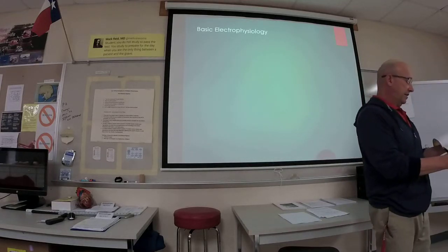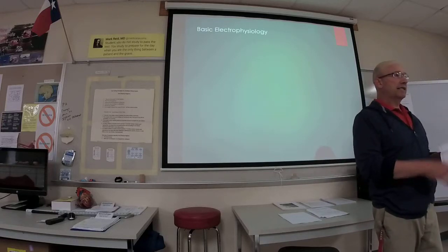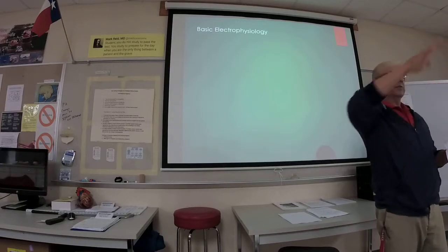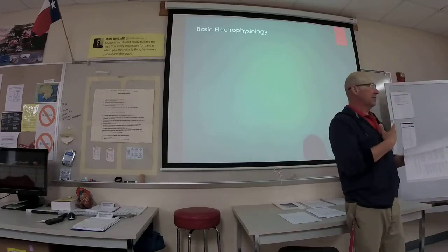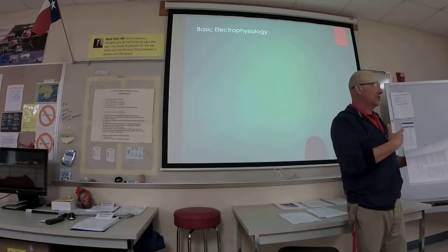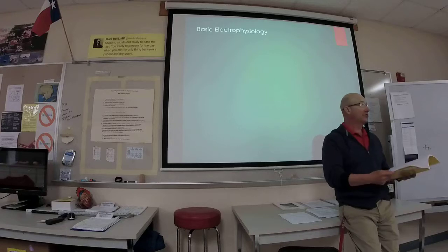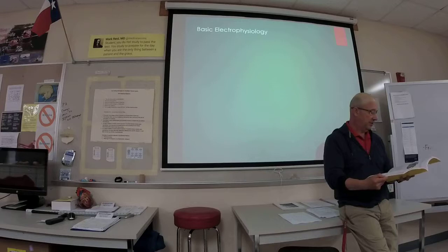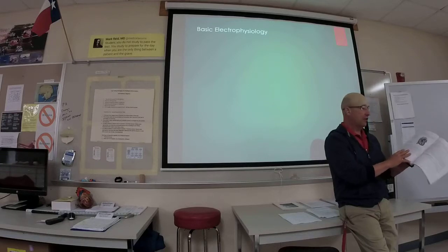We'll talk about different things, artifact and wandering baseline. In the hospital, you've probably already seen the EKG going up and down, and it's just artifact. Artifact is something that is induced into the EKG that's not supposed to be there, usually movement of the patient. Again, restudy the anatomy, the heart layers, all this stuff we've already done.